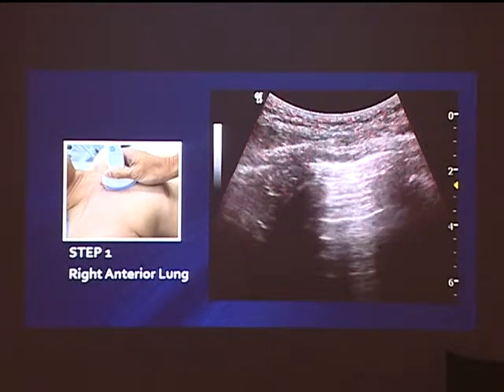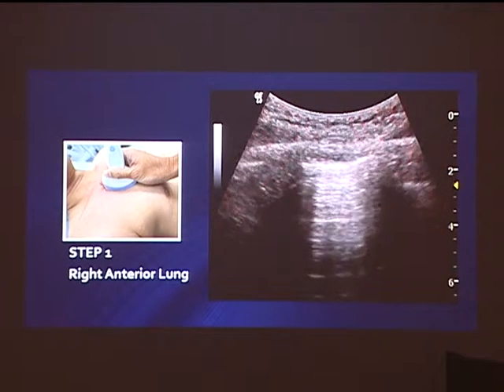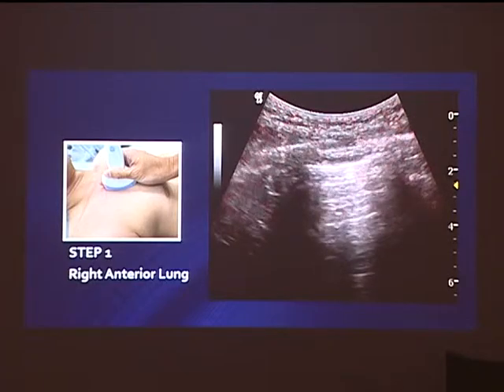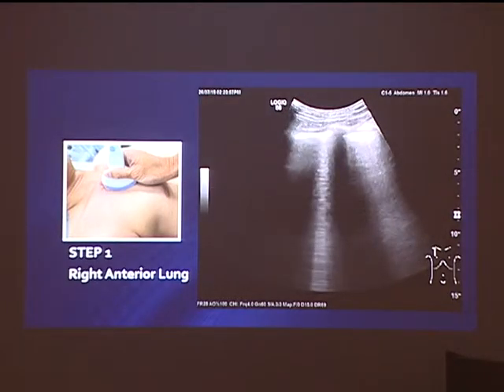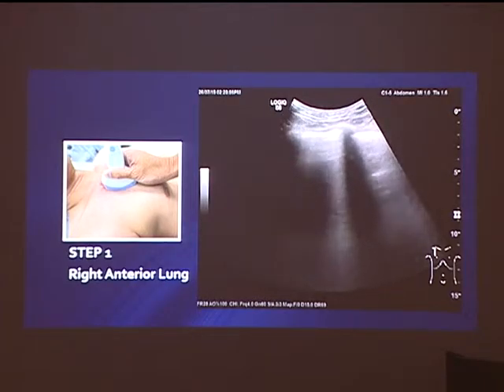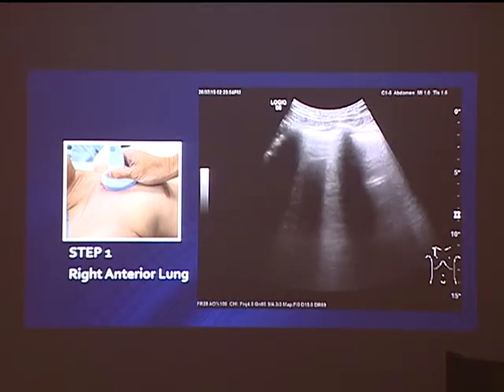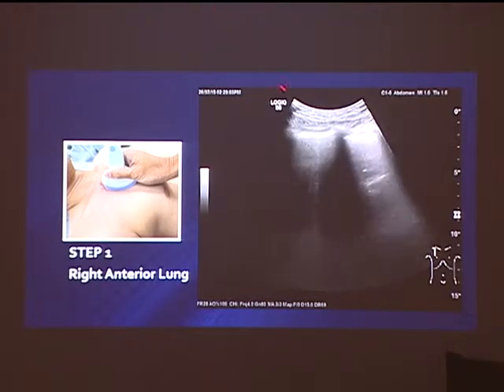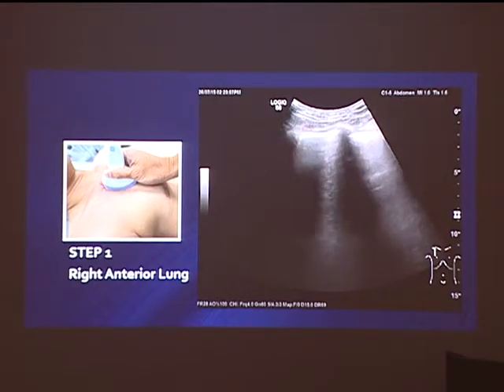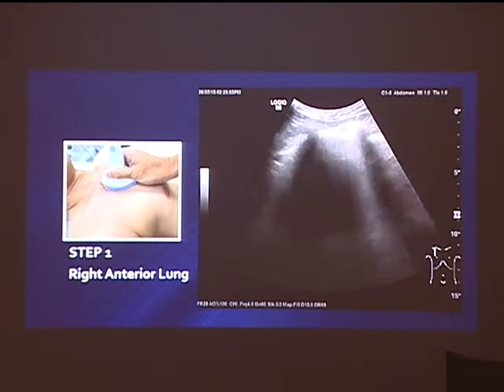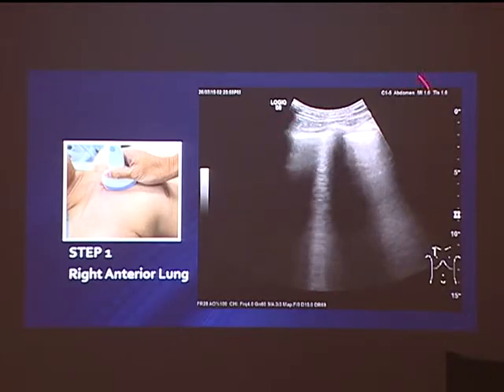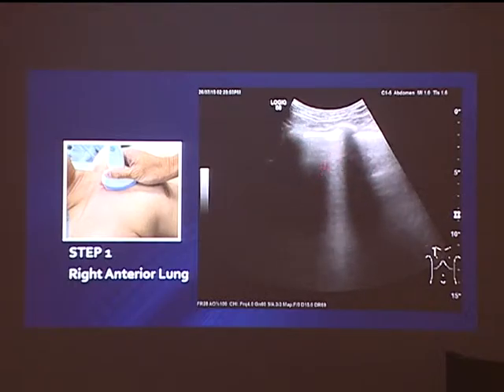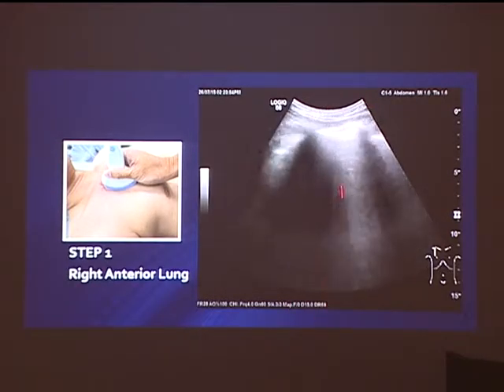Now let's look at pathology. This is the right anterior lung — lung sliding present, no B lines — this is a normal slide. Another patient: lung sliding present, so no pneumothorax. But there's something else that confirms no pneumothorax — B lines. B lines must start from the visceral pleura, meaning the lung is in contact. However, this B line is abnormal: it's in the intercostal space. In this patient — probably previously healthy before some injury — B lines indicate pulmonary contusion, meaning there's bleeding inside the lung causing thickening of the interstitium.